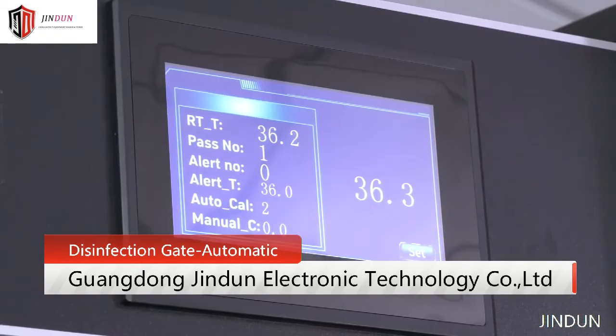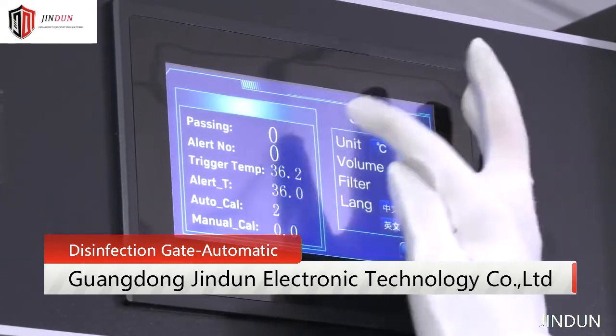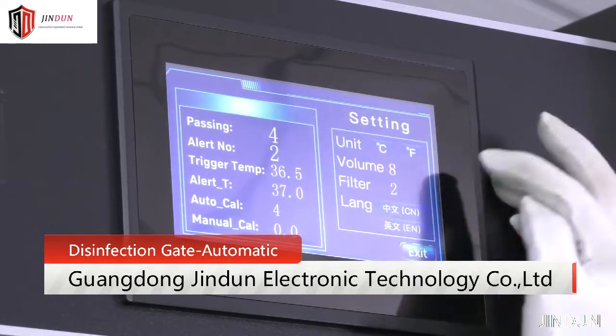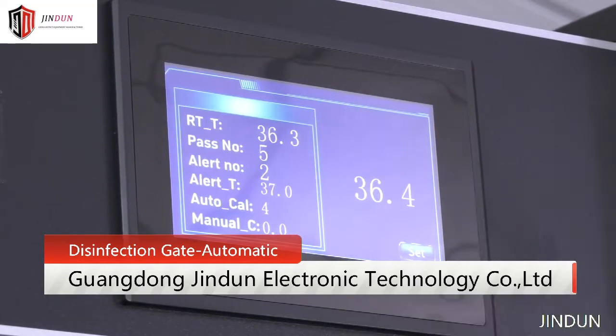7-inch touch screen. Easy and fast operation. Change parameters by touch screen. Custom language and other OEM service.